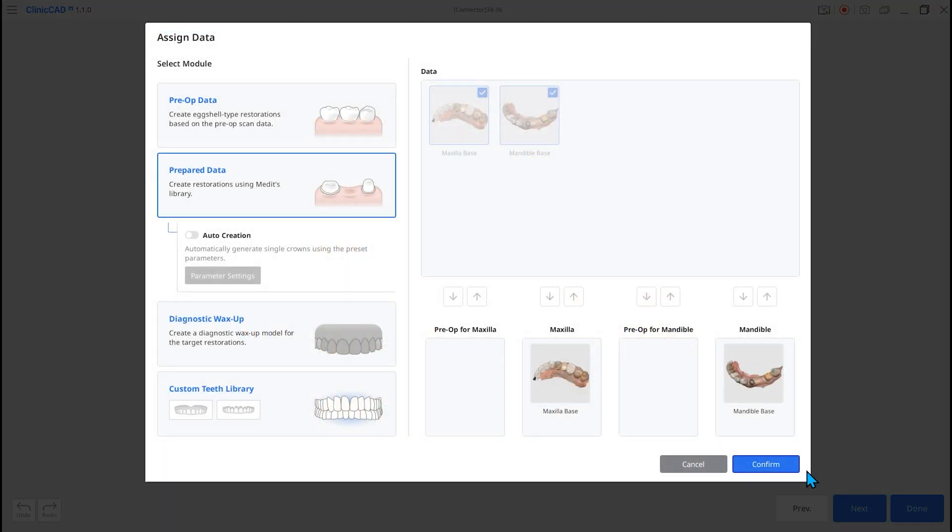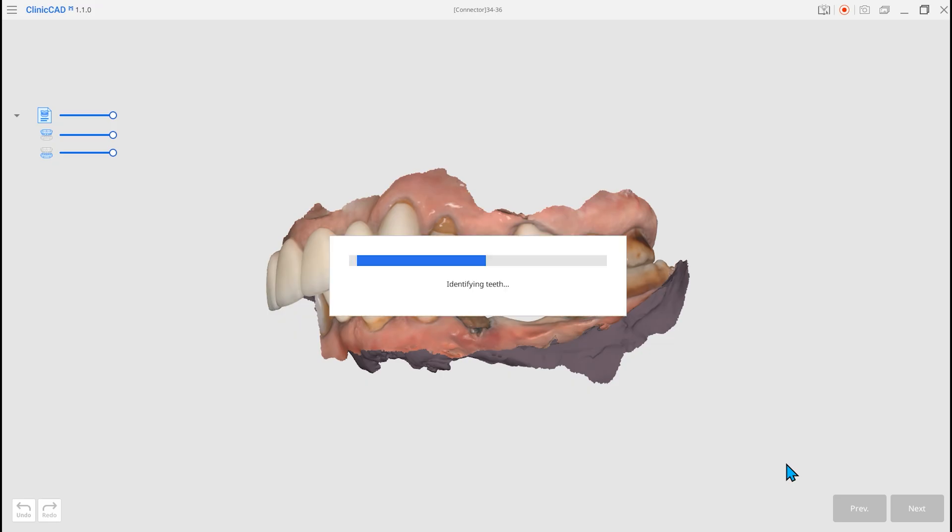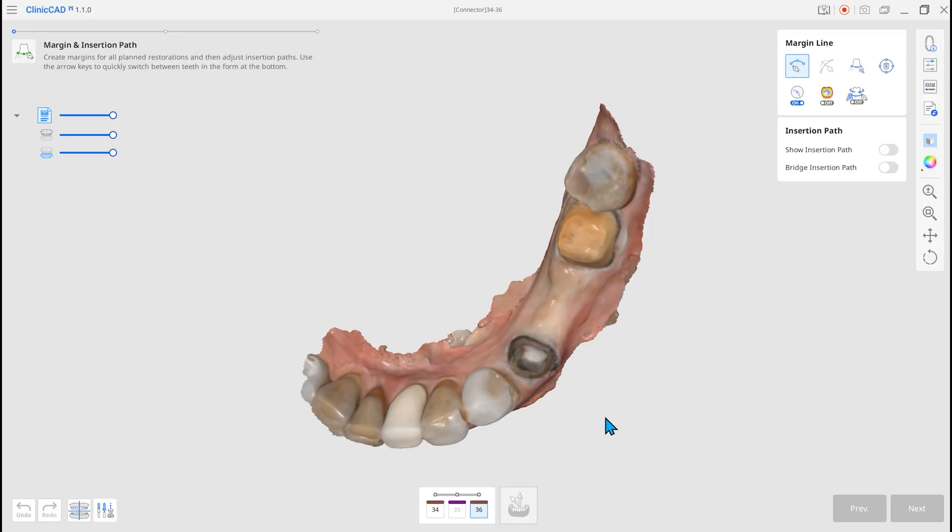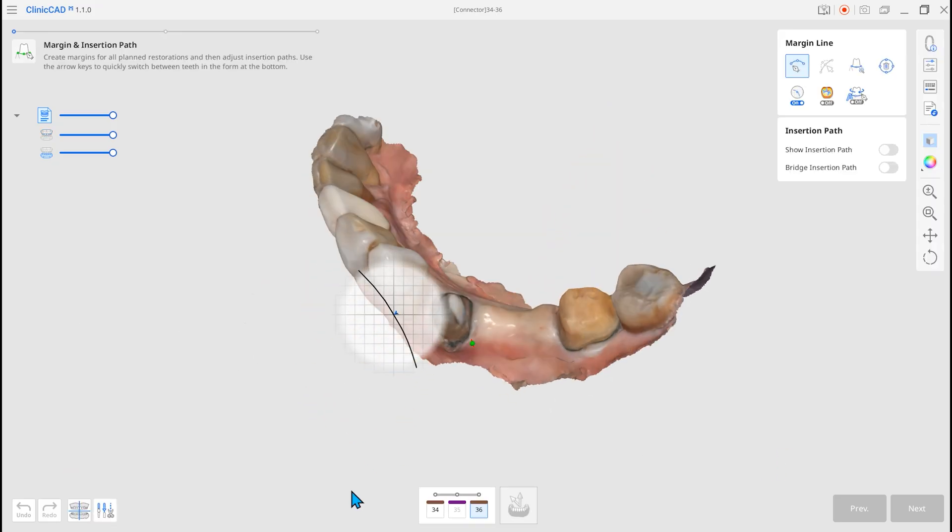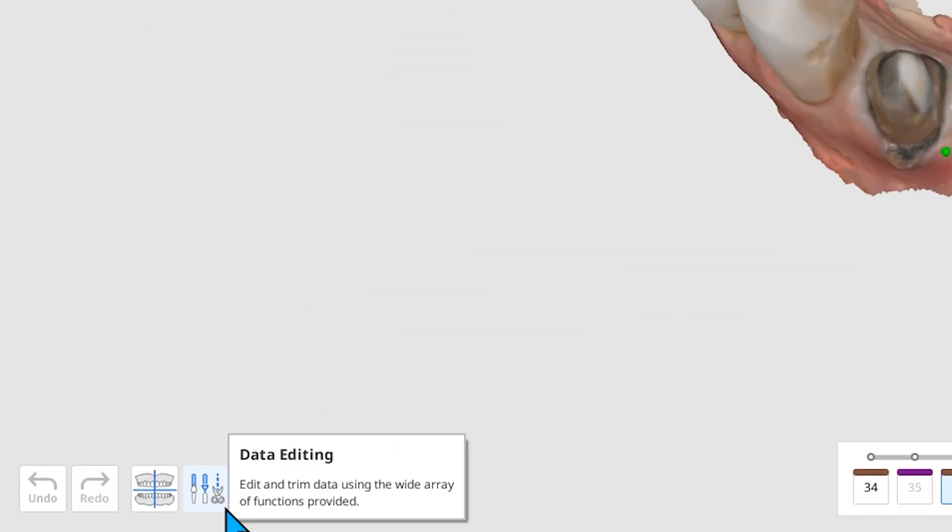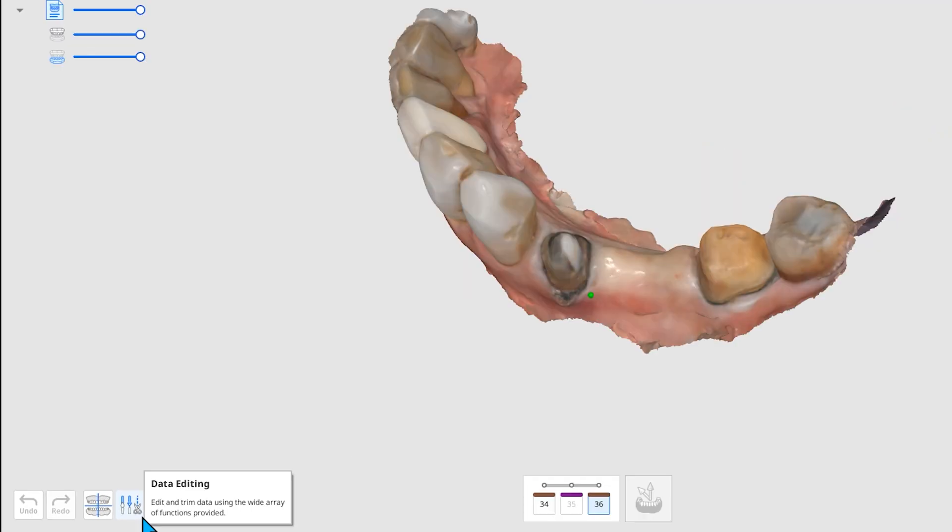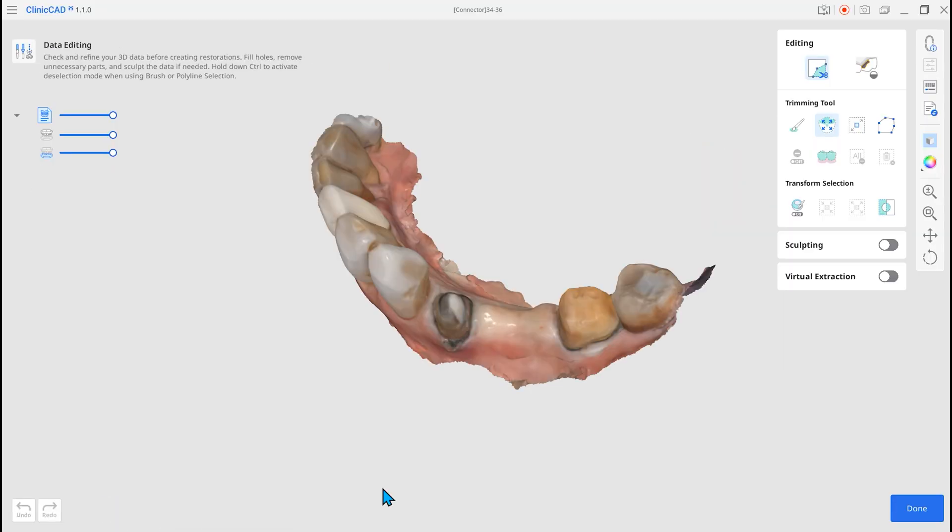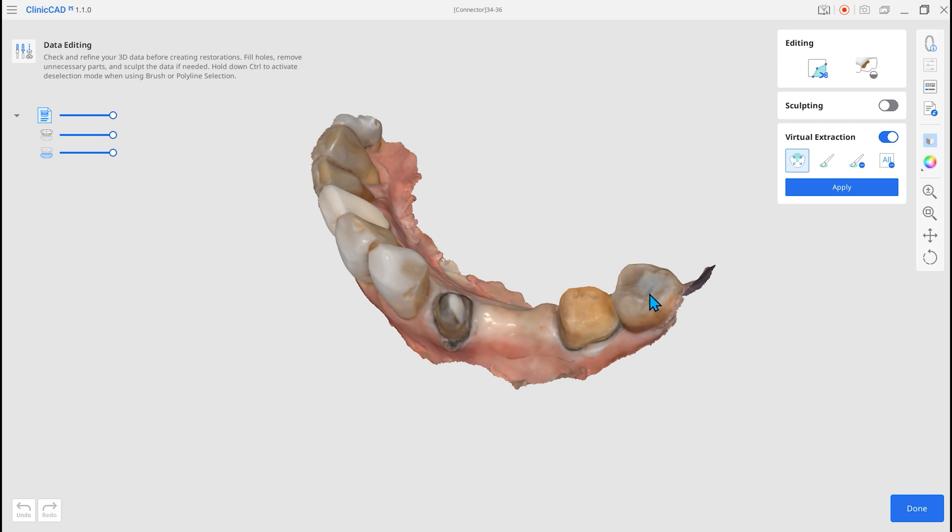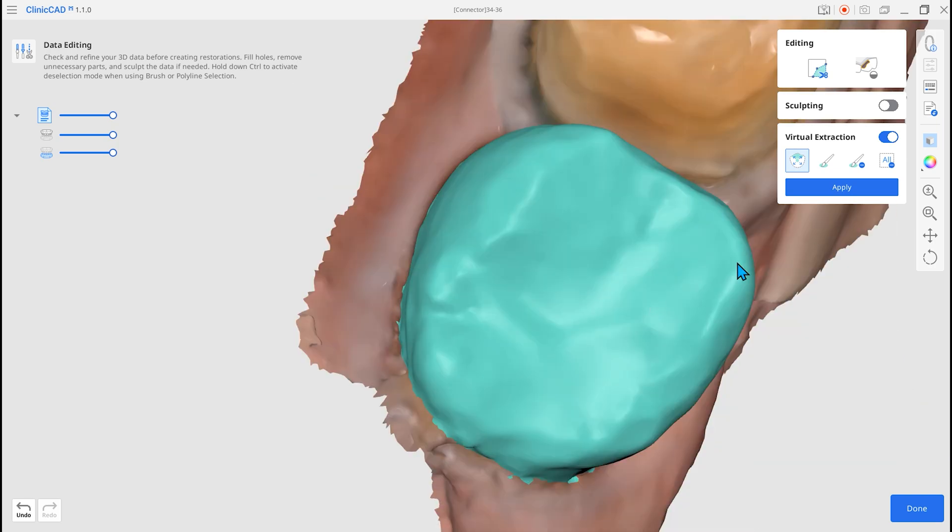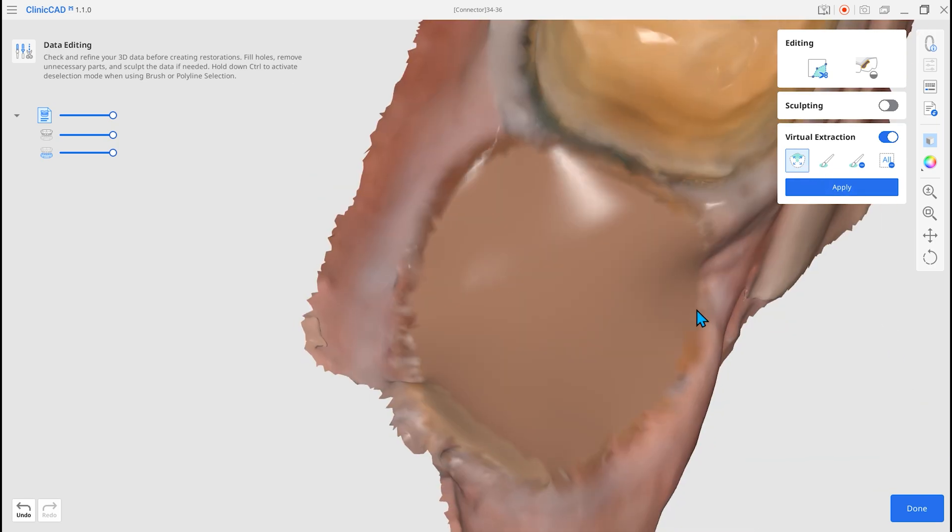Third, the Virtual Extraction is added. Enable Virtual Extraction in Data Editing. Select the tooth to be extracted, then click the Apply button to easily perform the Virtual Extraction.